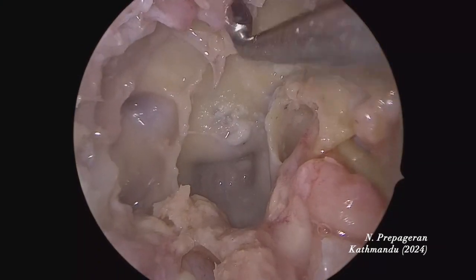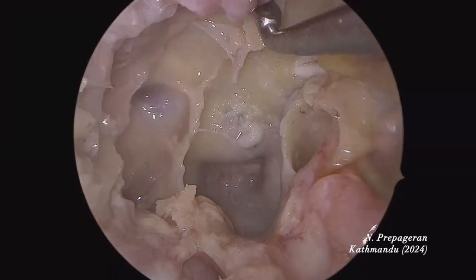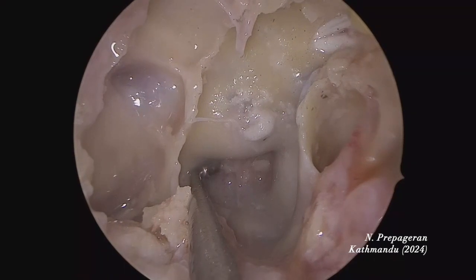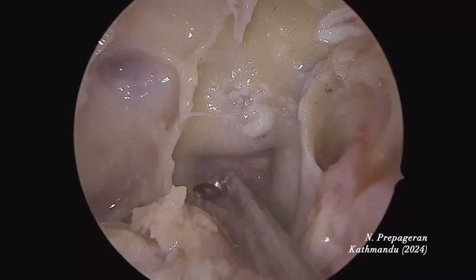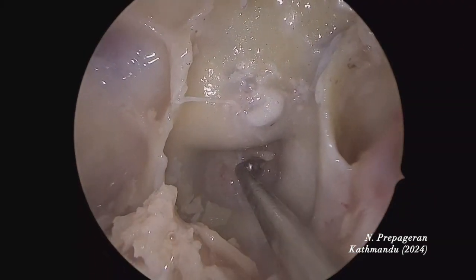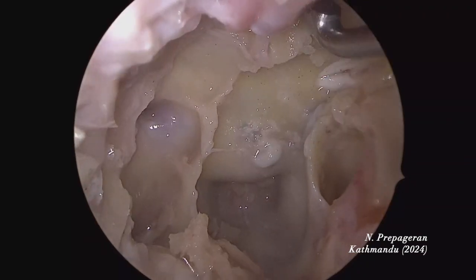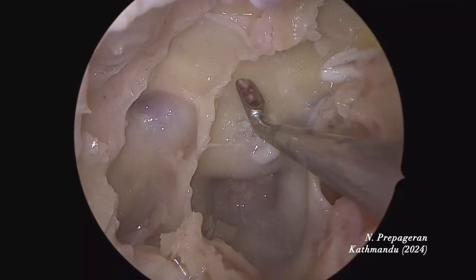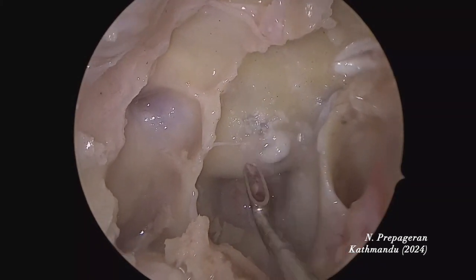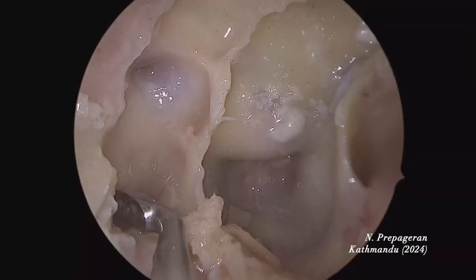This is the planum, up to here. Optic nerve, optic nerve, carotid artery, carotid artery. Planum is from here to here. That bulge there is the sella. Paraclival carotid, paraclival carotid. Transclival is going to be difficult here because the space is only about two and a half centimeters. Can you see how small the space is? The tubercle is this one here. Planum is from the anterior wall of the sphenoid sinus, sloping down to here. This is horizontal tubercle. This is the sella — the bulge. This is the clivus. This is V2.